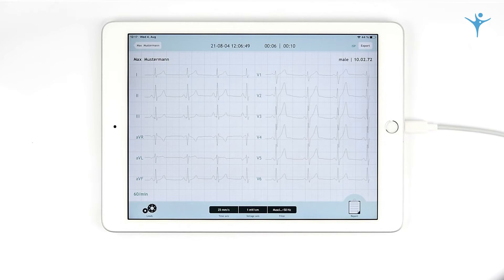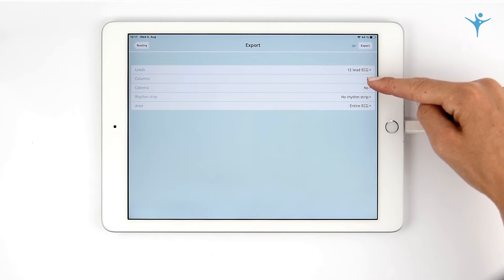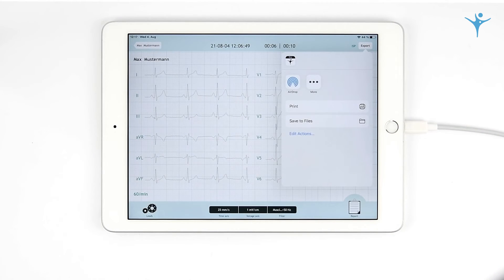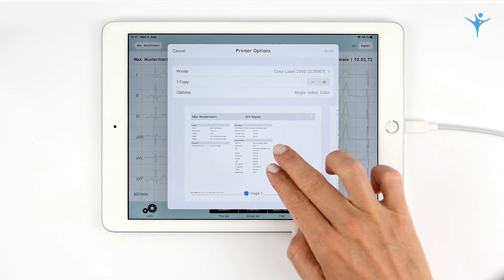Before exporting, Cardio Secure offers you several display preferences for your PDF report. Readings can be easily and securely exported via AirDrop, AirPrint, and email intranet.